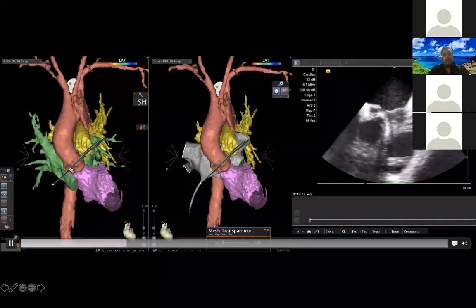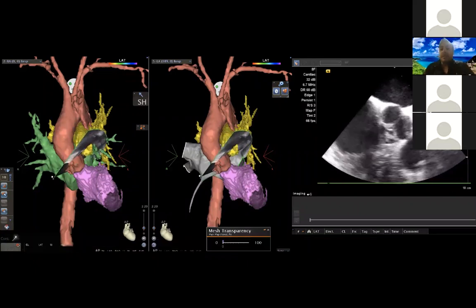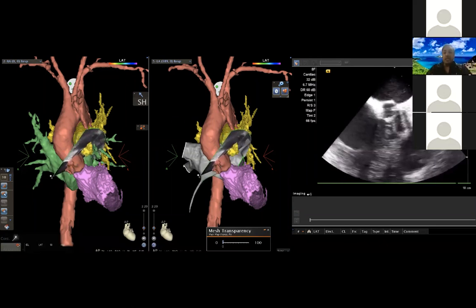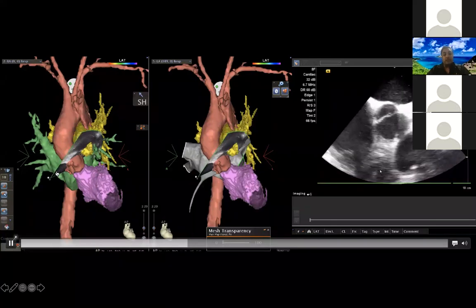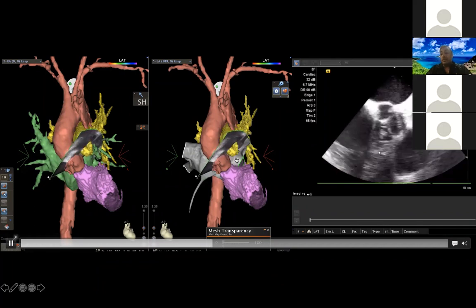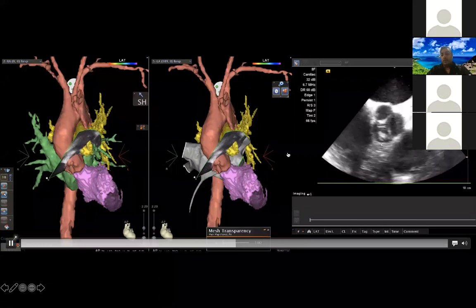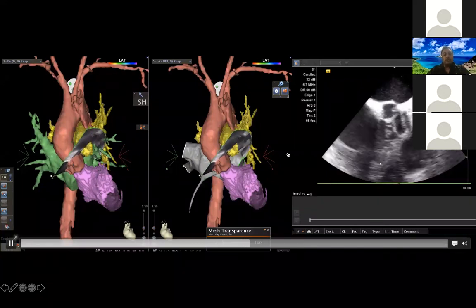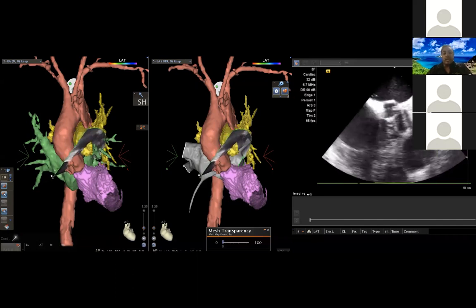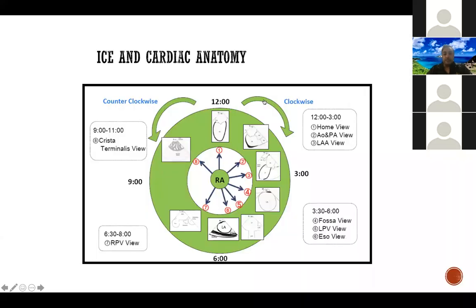And you can see, you're looking at the aorta here still, but you're just looking at it from another vantage point. And then you'll begin to notice little things, and I'll show you this later. But what I found is actually, if you're trying to visualize the coronary arteries, you see the right coronary artery much better from the right atrial view of the aorta, and you see the left coronary artery and the left main much better when you're in the RV. And you can kind of appreciate that here. You're cutting right through the right coronary artery here. So the more you look at these structures, you'll notice little nuances that will allow you to understand where you are and use the technology for your advantage in your ablation.